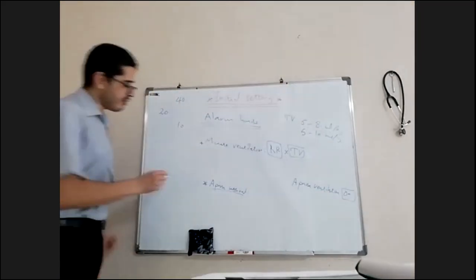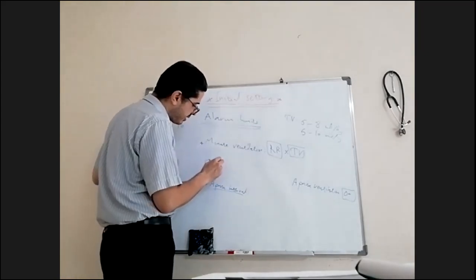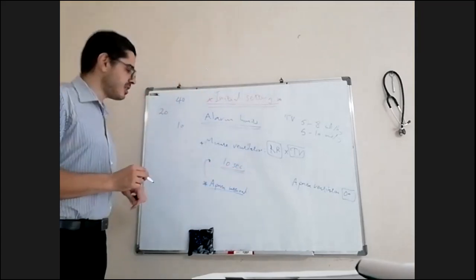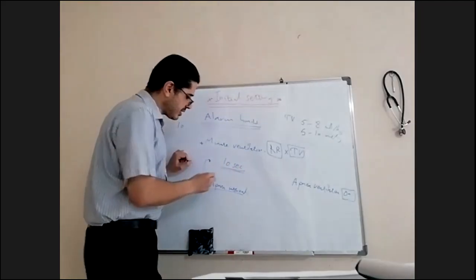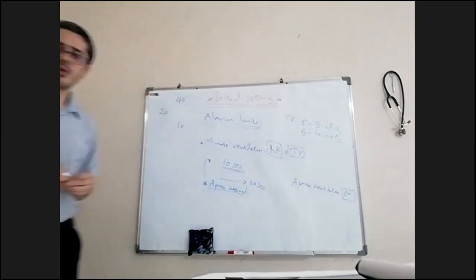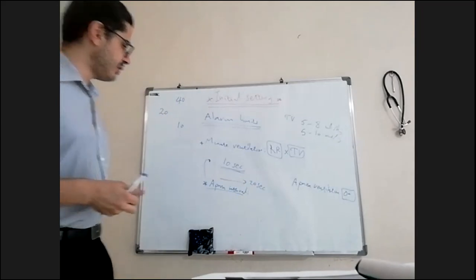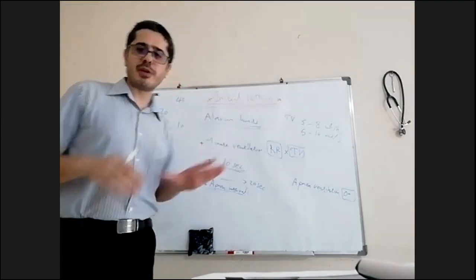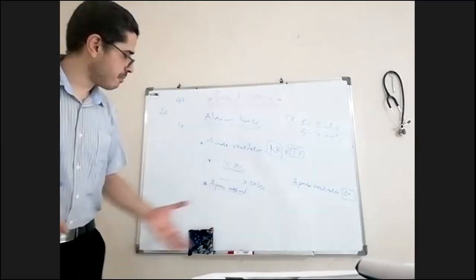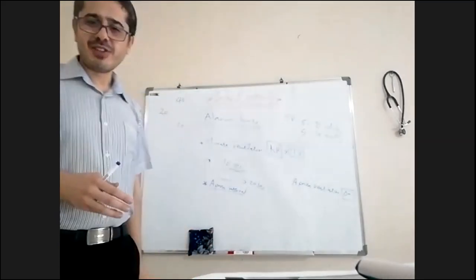So the apnea interval, in neonates and infants, we make it 10 seconds. In older children, 20 seconds. So the ventilator will give you an alarm if you pass that time without ventilation. It starts alarming, and you will come to the patient. If you have apnea ventilation on, don't worry. It will alarm, but the machine will keep giving the ventilation to the patient.